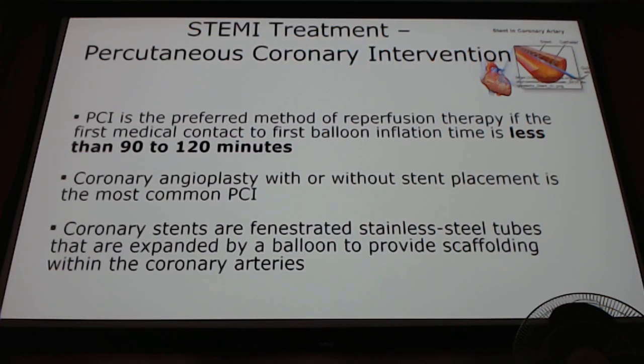And what we're going to do is place a stent in there. You can kind of see how the pictures look. So they go into where that thrombus is, and they place mesh in there or a little stent to help expand that area, so that we can reperfuse or get blood flow back to those arteries in that area of the heart that's been hit.